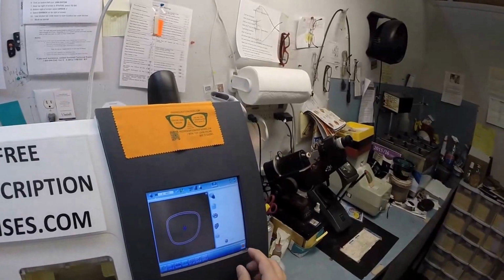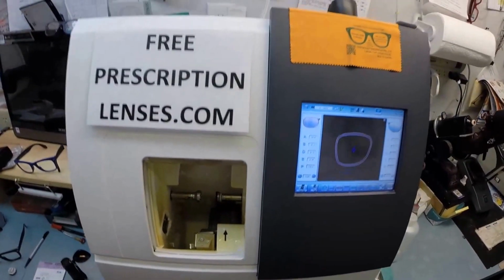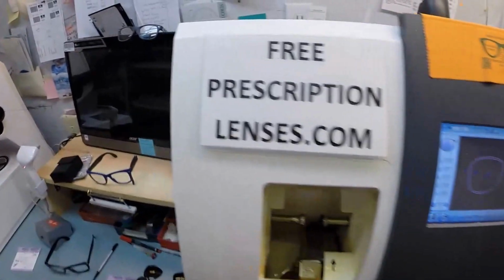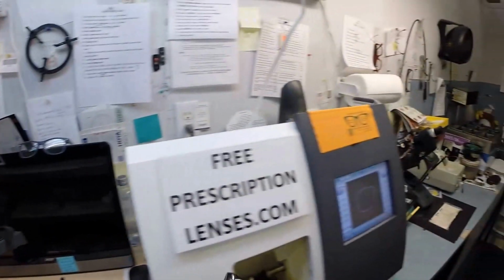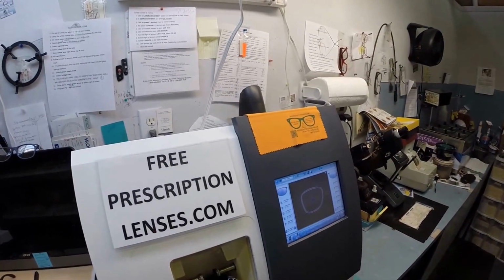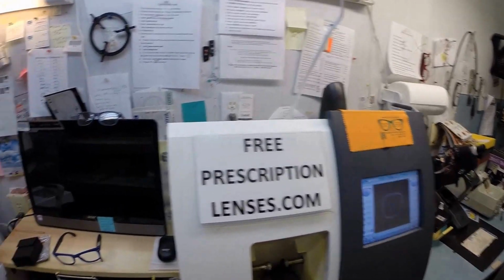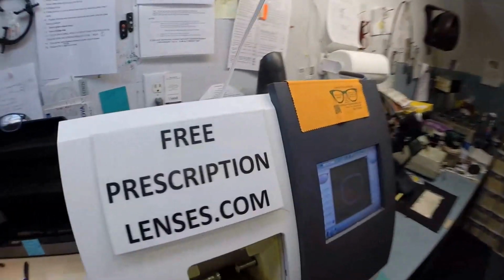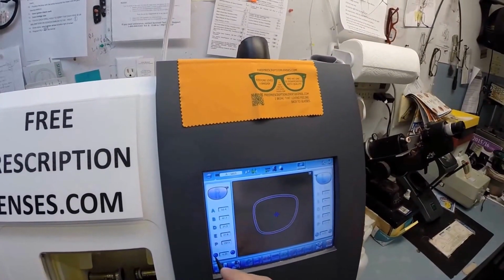So I will take the lens out now. Let me open up the chuck. Thank you, Charles. Chucky baby. And make sure everything is cleaned up. Again, I'm going to tuck it in at the outside corner first, and then using my thumbs I press down at the nose, and it still does not want to go in, which is typical of a Wayfarer. I'm going to take it down another 0.2 of a millimeter until it pops in there easily. I'm going to hit the retouch button again.